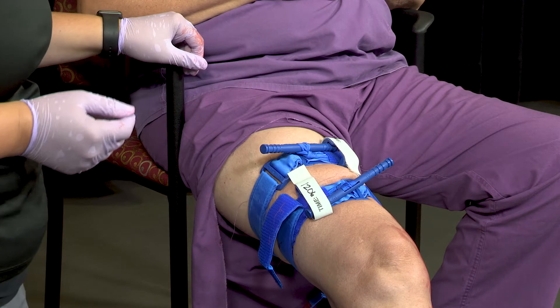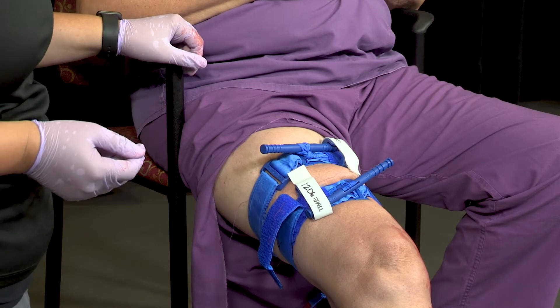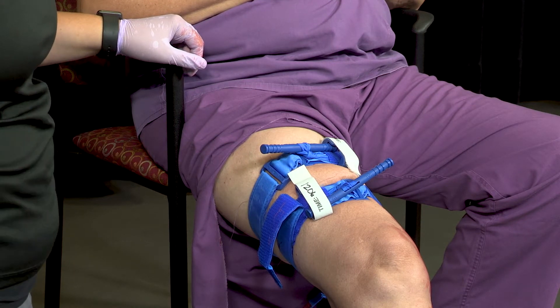If the bleeding is not controlled, assess if the windlass can be further tightened. If it cannot be tightened further, place a second tourniquet more proximal, or closer, to the victim's body.